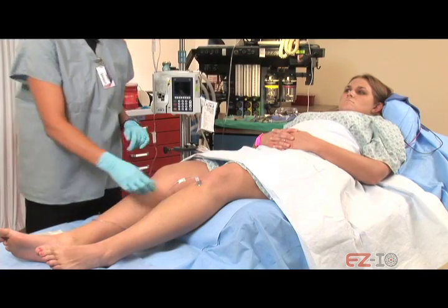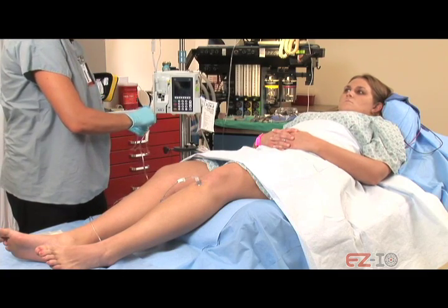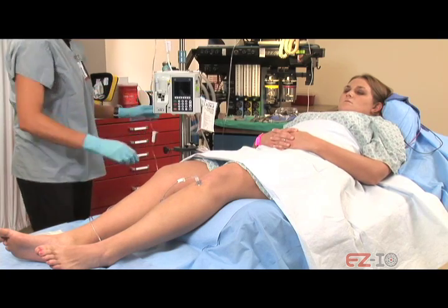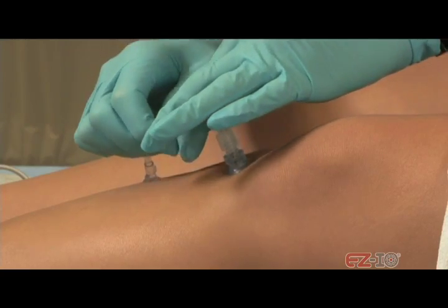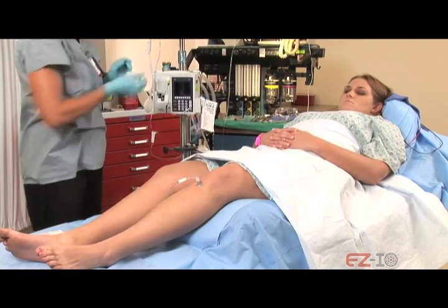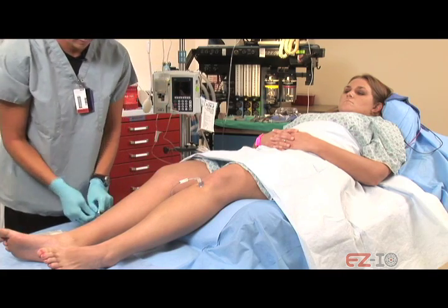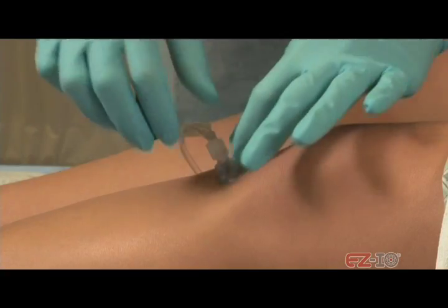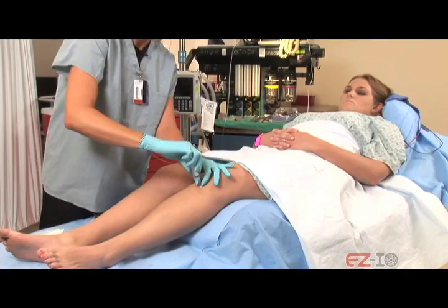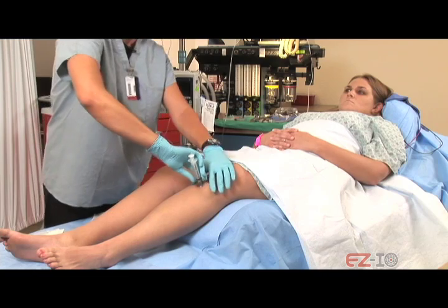Okay, Kelly, we're ready to get this out, okay? Okay, all I'm going to do is I'm going to twist and pull this straight up while I'm taking it out, okay?